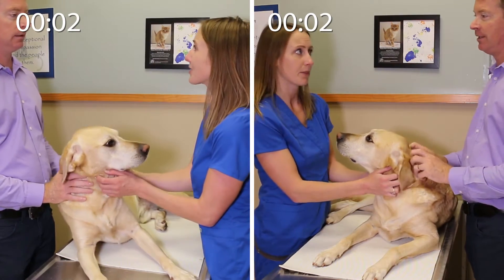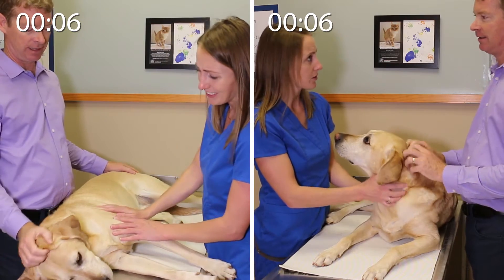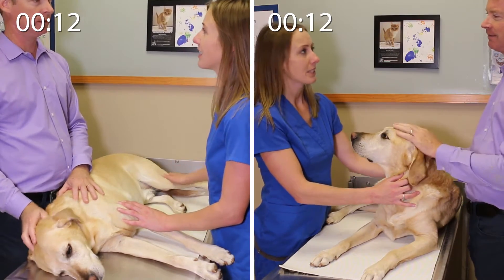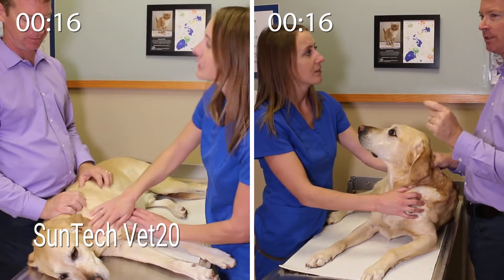Meet Tucker! In this video, you will watch as Tucker gets his blood pressure taken using two different methods during a typical visit to his veterinarian. The left side of the screen will show the measurement being taken with the SunTech VET20, an oscillometric blood pressure device.